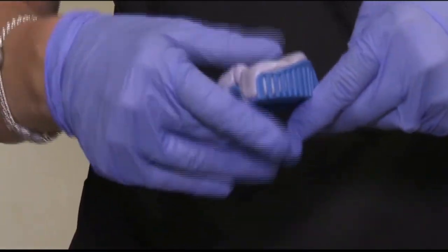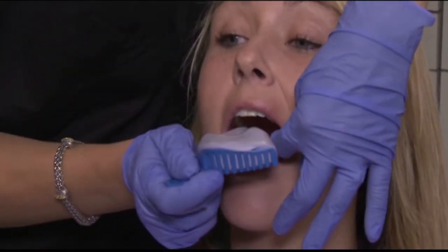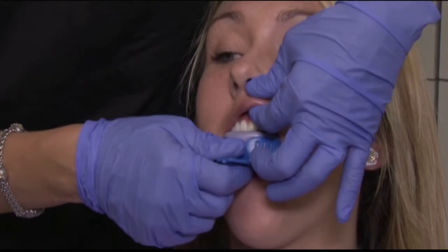And then we're going to pat it down, and I'm going to go right in the mouth. Don't touch any of the teeth. Pull the lip up. You see how I've got that lip, and I'm going to push.